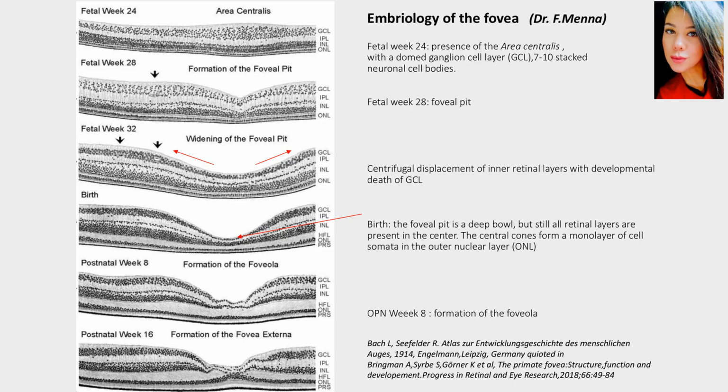The foveal pit is proposed to be formed by a vertical contraction of the central Müller cells. After widening of the foveal pit, likely mediated by retracting astrocytes, Henle fibers are formed by horizontal contraction of Müller cell processes in the outer plexiform layer.